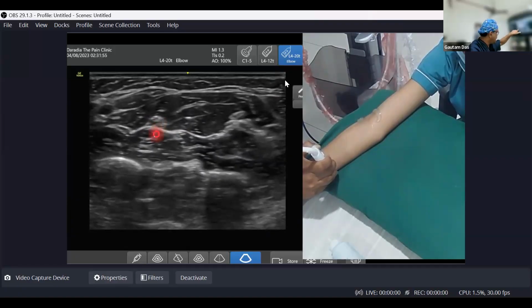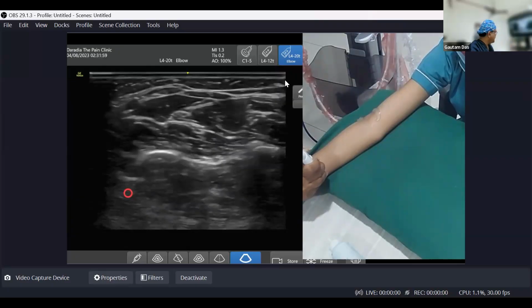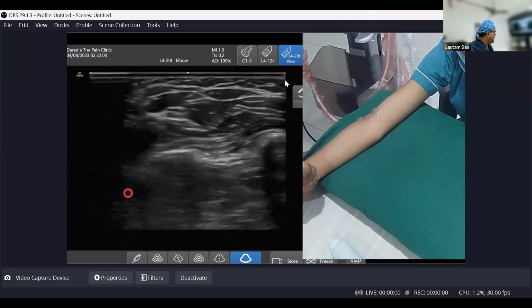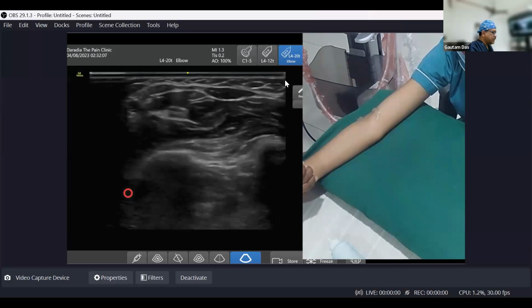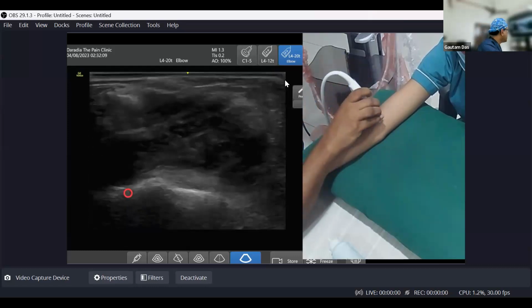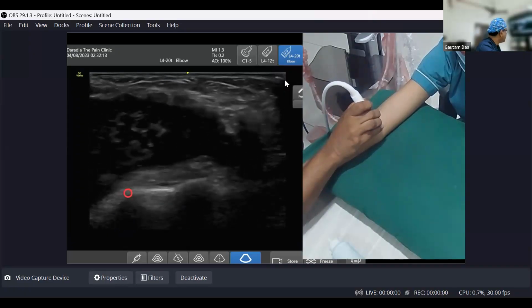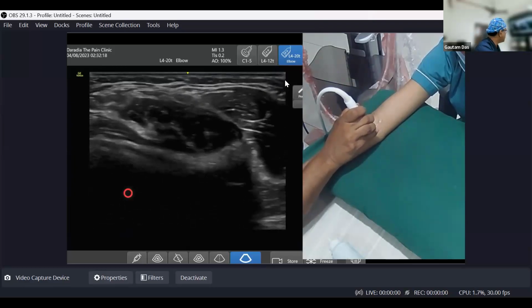Here I can follow, here, here, here, and now it is entering into the carpal tunnel. So this part I will be demonstrating in the next class. So now this was your median nerve. Again, just quickly recapitulating, this was your median nerve.